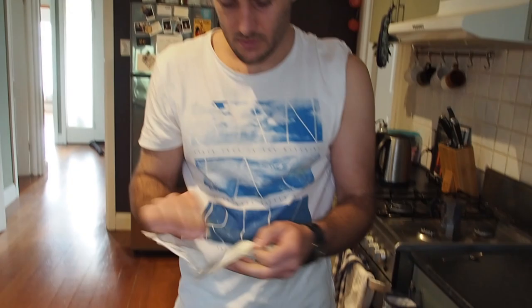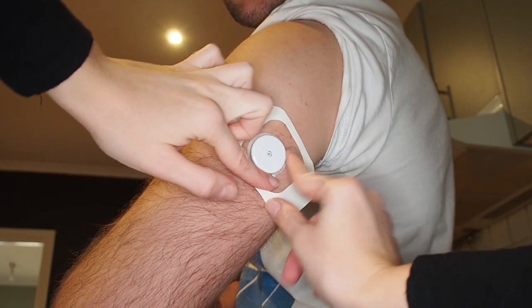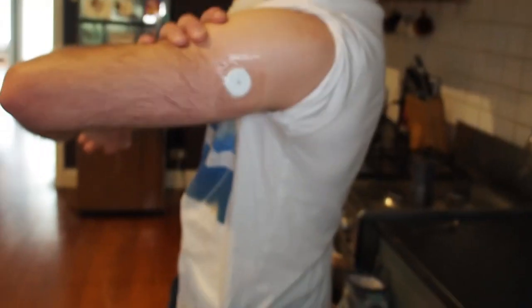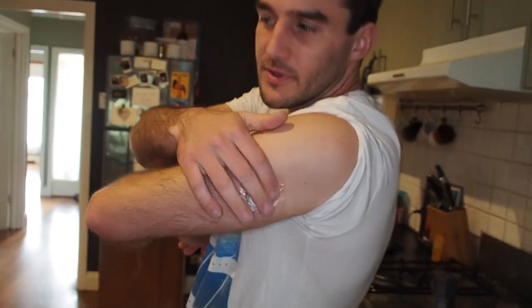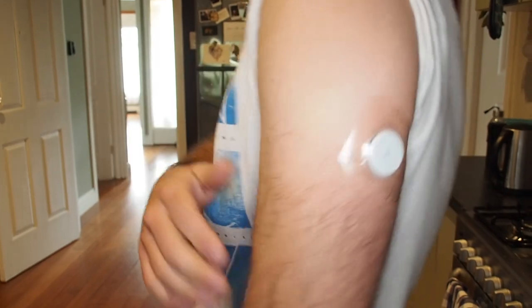The 1624W I find to be the right size. I've got to be careful because I don't want any air bubbles — I'm going to try and make this as airtight as possible. Definitely get a friend to help you out, that's pretty hard. I found this one to be the best because it flexes with you, it protects it, holds it on so it doesn't peel off, and it's also protected from most water.